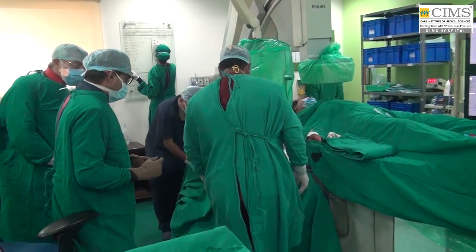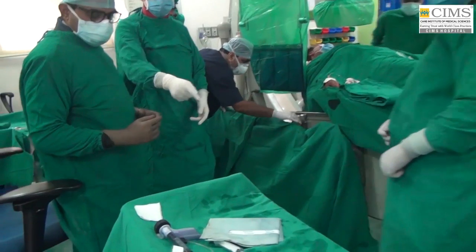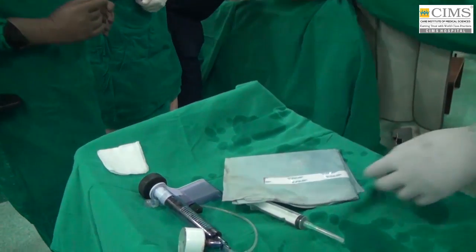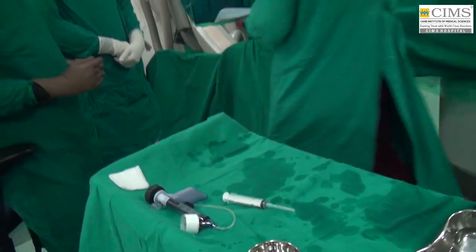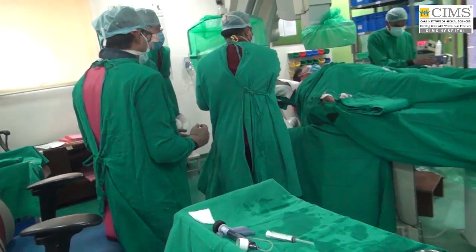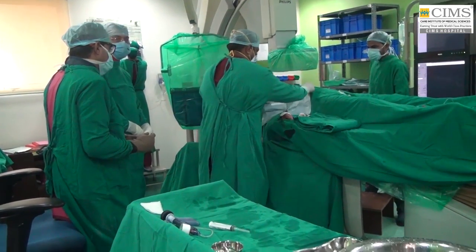Yes, I agree with you. As you know, in all CTOs we use 7 French guides. Again, the symptoms are reasonably acute, but the long dissected area does suggest there may be chronicity in this lesion. I agree with you.